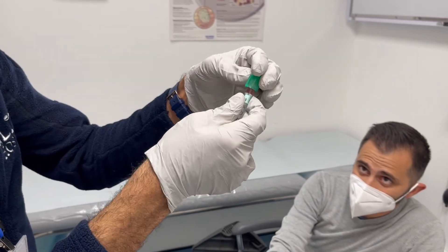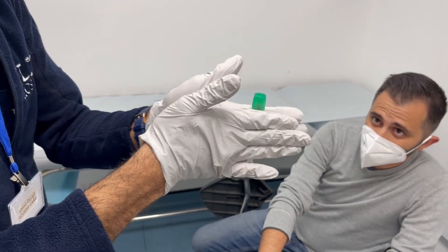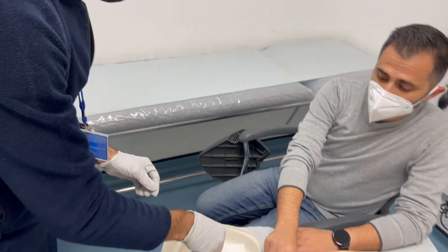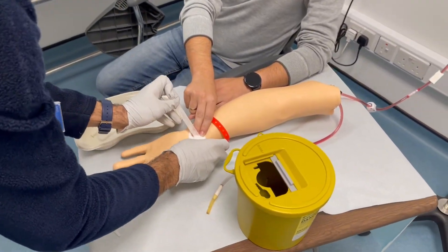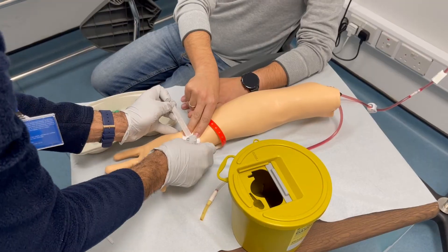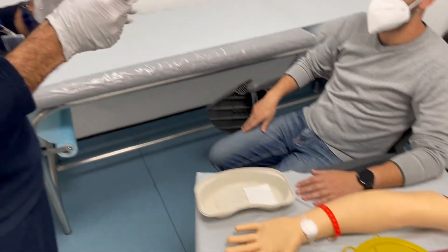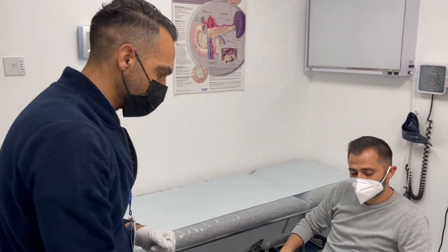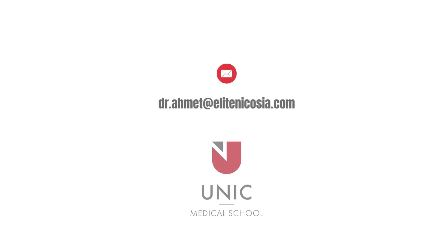I'm just going to cap this and gently rotate it so I can heparinize the blood so it doesn't clot. I will place the tape over your hand and I will come back in five minutes to check up on you. I'm going to run this through the analysis and we'll get back to you with the results shortly. Thank you very much. Bye.